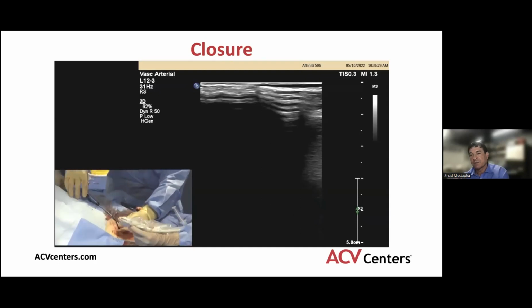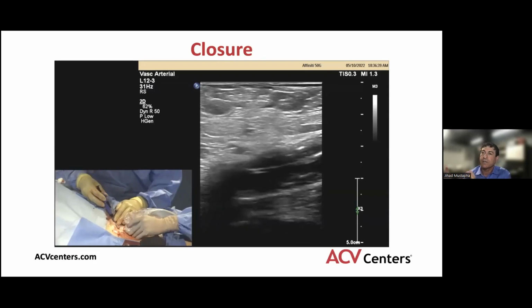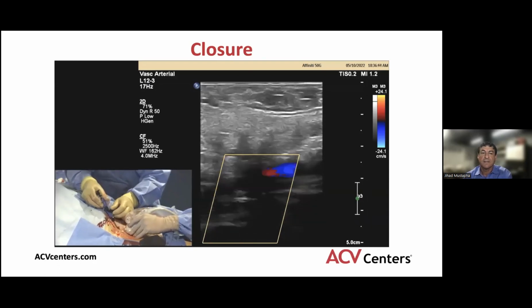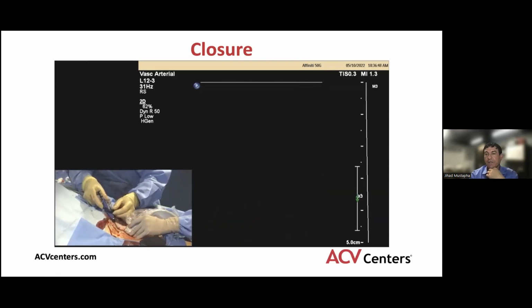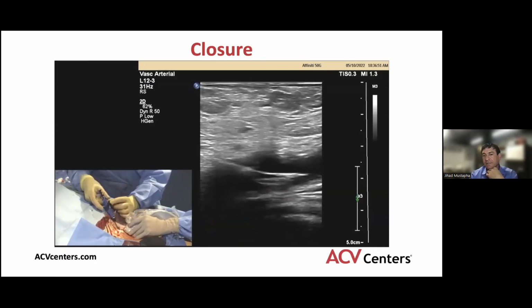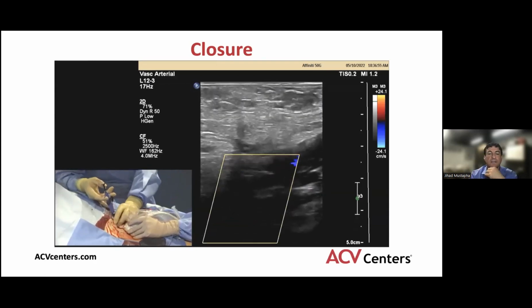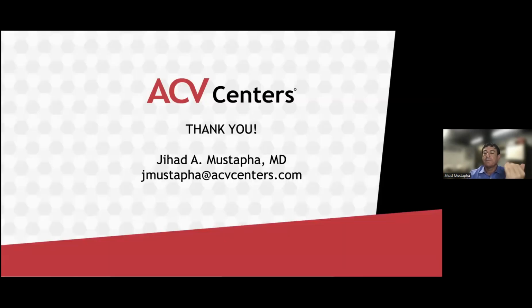Again, ultrasound-guided access was done to ensure an exit strategy. Because of the confidence in the access under ultrasound, we decided to deploy a closure device under ultrasound as well. Here are the plates being deployed and pulled back against the vessel wall, and the closure device was deployed. This is for safety and success of the deployment of the device and getting good hemostasis.